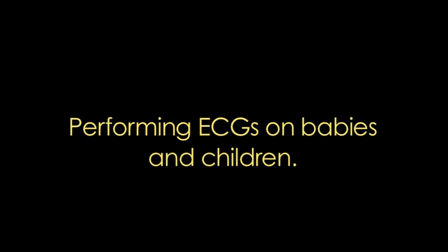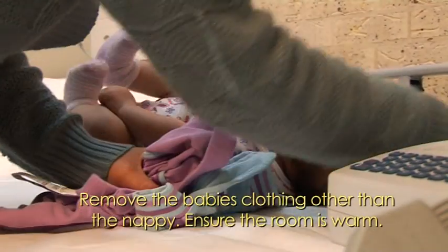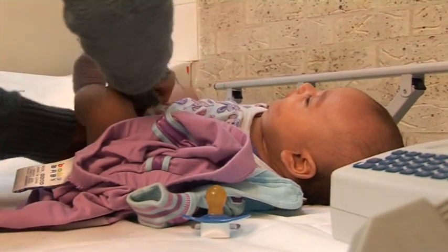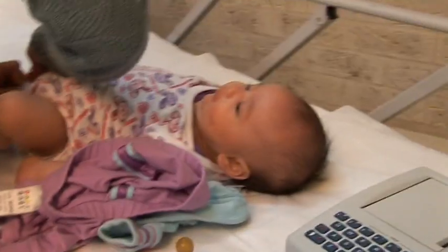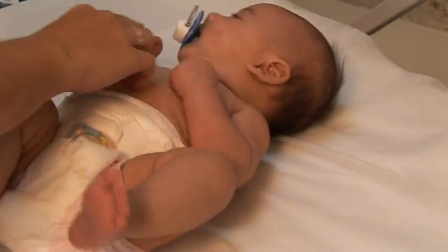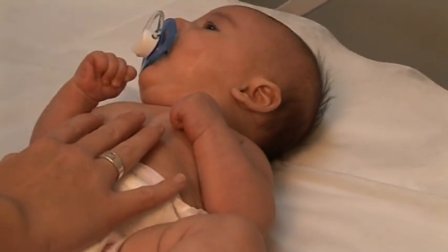Performing an ECG on a baby or child is exactly the same as an adult, only scaled down to the appropriate size. The trick with children is encouraging them to be still whilst the procedure is happening. Ensure that a baby has just been fed and comfortable, and explain the procedure thoroughly to children so they are not afraid.